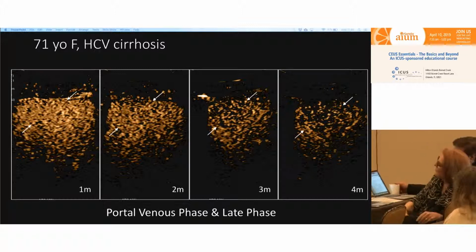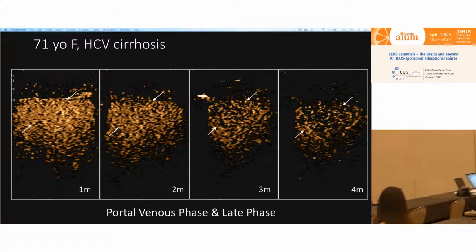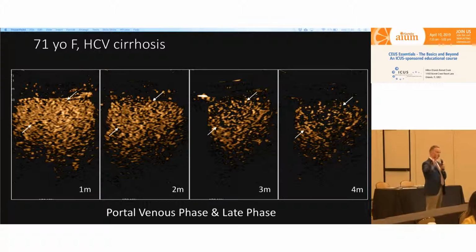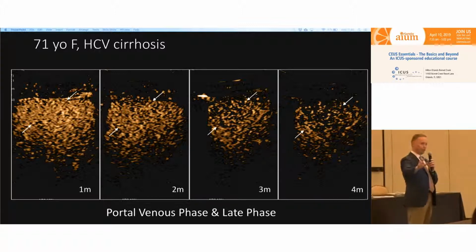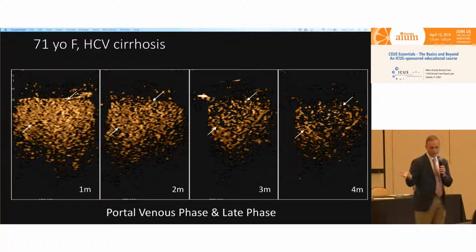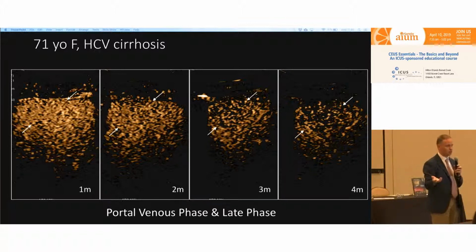So one of the things for this that we ask our sonographers to do is we ask them to keep their hand with the transducer on the patient in the window that they used for early scanning. Because if you take your hand off, turn around, go have a cup of coffee, and you come back, you will be looking at this patient like you've never seen this patient before.